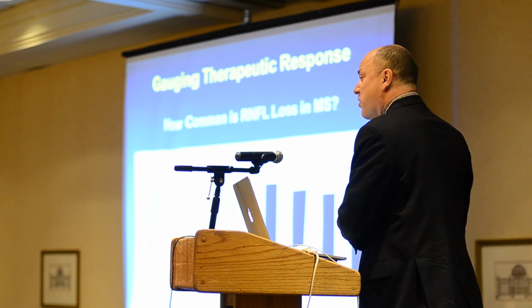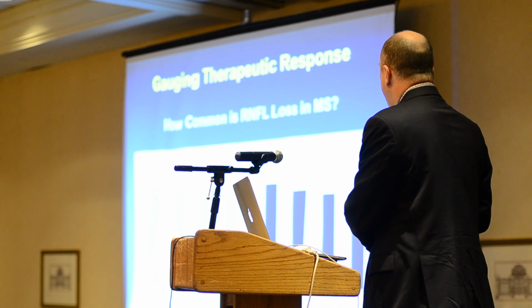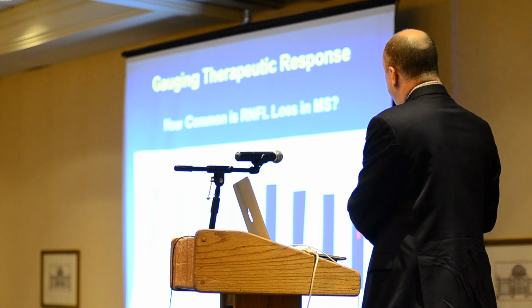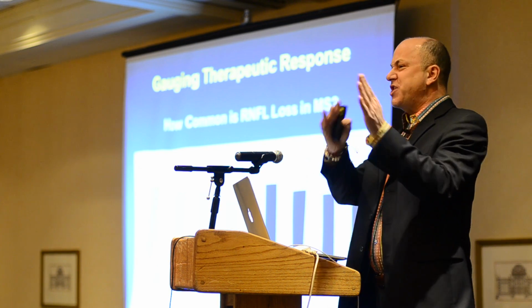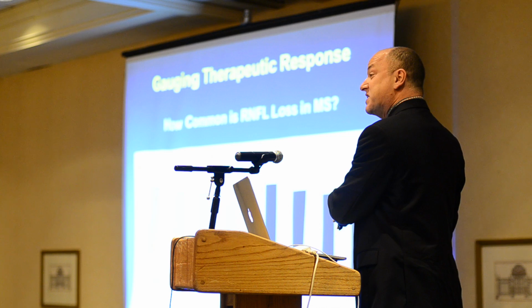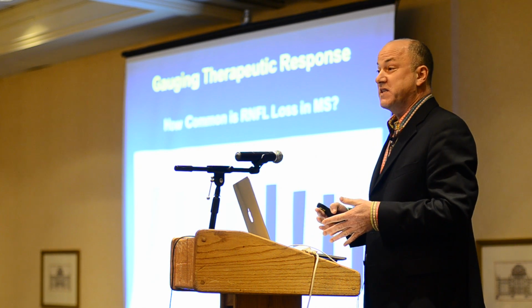But also, what's more important is it better be present in all forms of MS. And here you have patients with relapsing remitting disease, patients with primary progressive disease, and patients with secondary progressive disease. So no matter how much we chop up this disease, whether you've had optic neuritis or haven't had optic neuritis, whether you have relapsing disease or progressive disease, we find changes on your OCT.